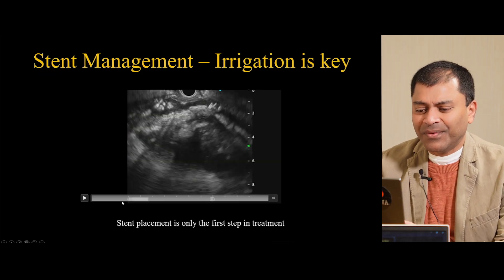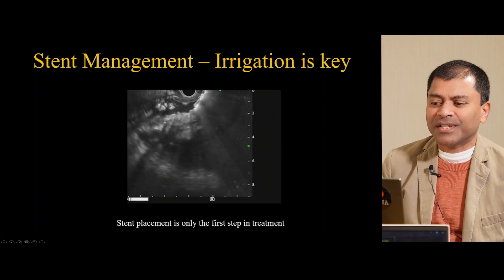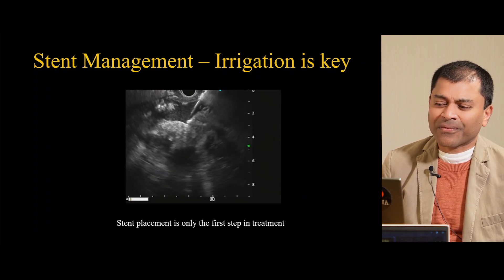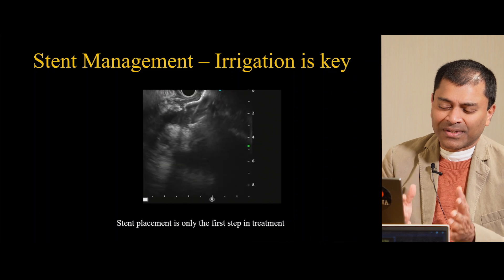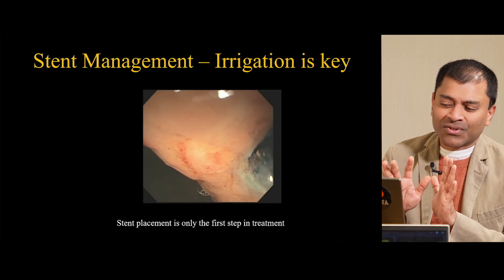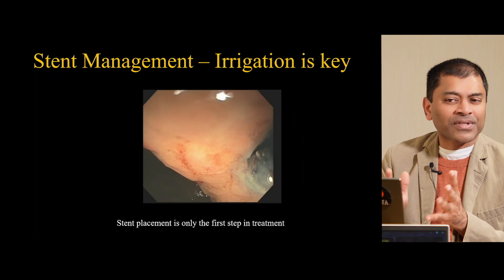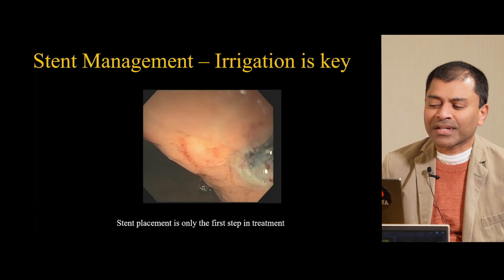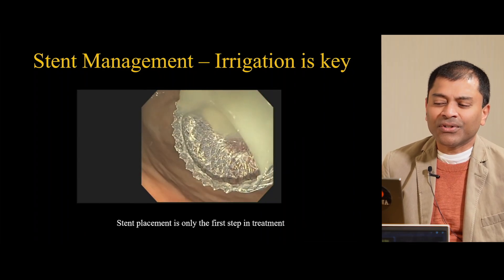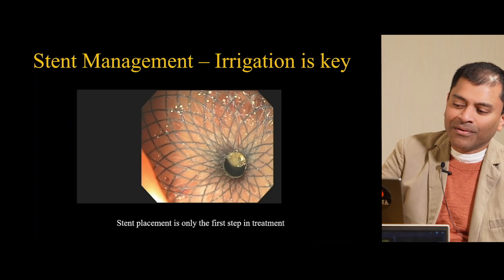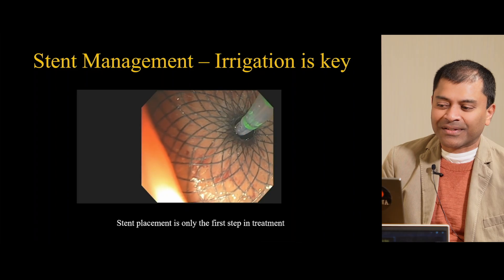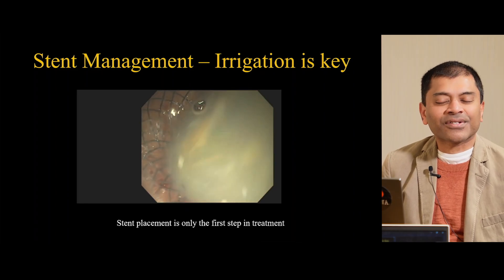This video shows you why irrigation is key. You can see there's a lot of necrotic material in the stent and within the cavity. After you deploy the stent, the necrosis, as the fluid evacuates, has a tendency to go into the lumen of the stent and cause an occlusion. These patients in another two days continue to have fever and an elevated white count. When you come back, you will always see this mound of tissue. That's why irrigation is important.